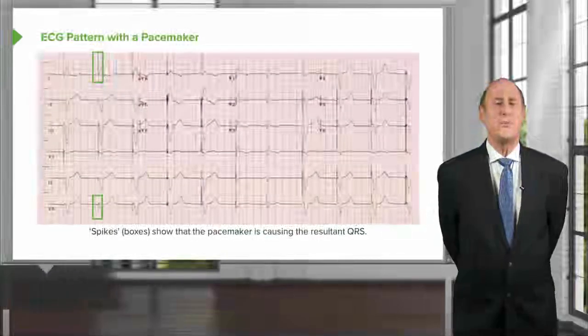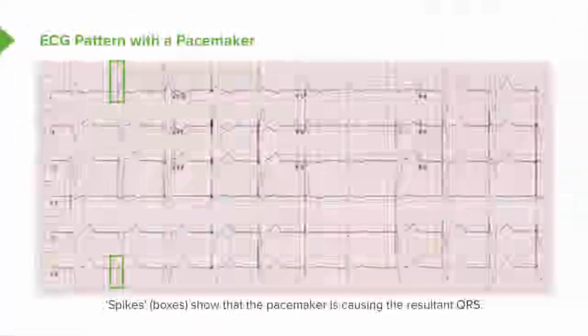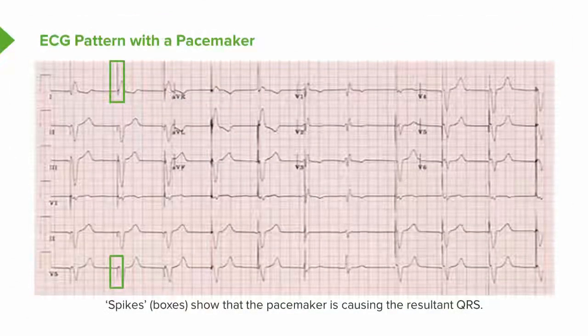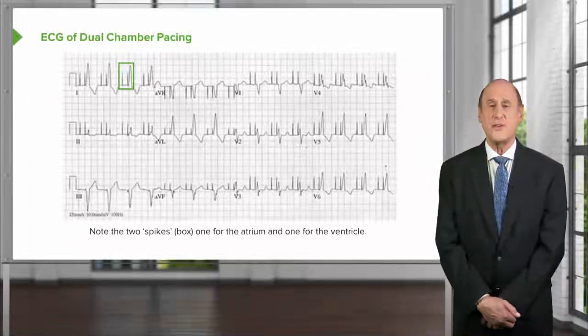And here we see an ECG with pacing spikes. Let's look at the bottom, which is the rhythm strip. Okay, the first beat, the first QRS, has a spike in front of it, so it's paced. The second beat with the green box is just like that. There's a spike and a QRS. The next beat, the third beat, spike and QRS. The next, spike, QRS, spike, QRS, spike, QRS. Oh, a normal beat. And then another normal beat. And then spike, QRS, spike, QRS, spike, QRS. You see this pacemaker, in this patient, was appropriately inhibited when there were two normal beats that occurred.